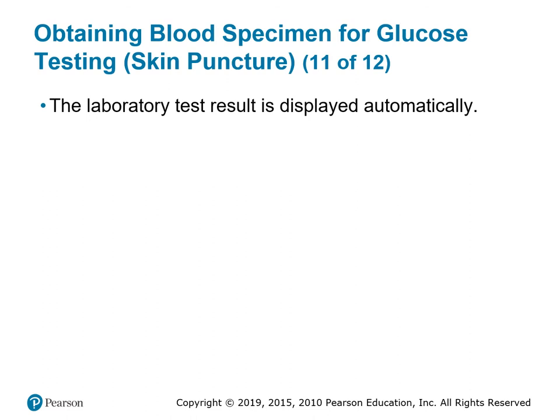All right, the laboratory test results are displayed automatically. And what that means is, just as soon as you put the blood in there and it reads, it's going to give you your results.